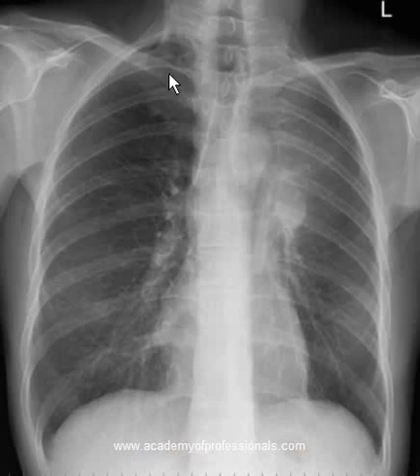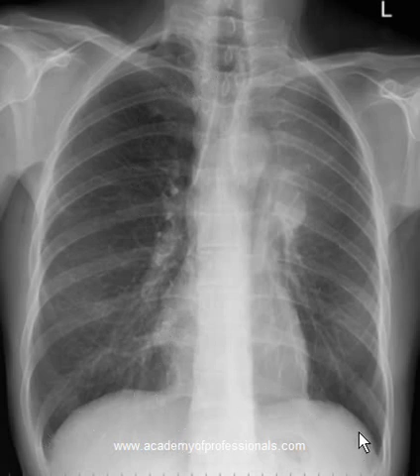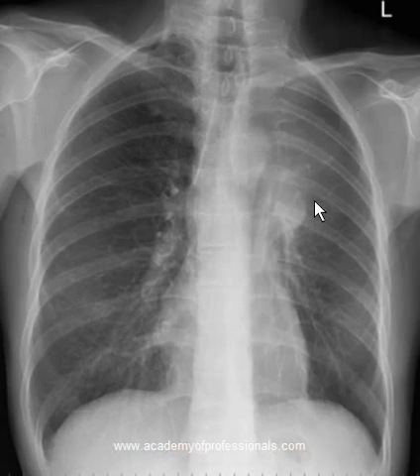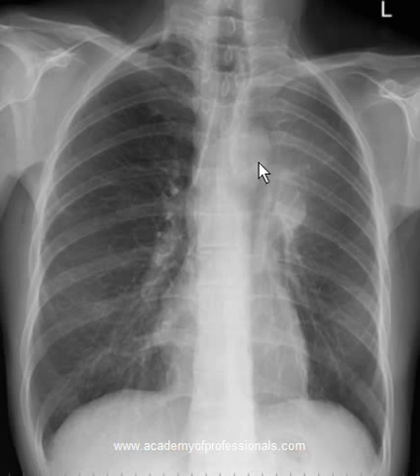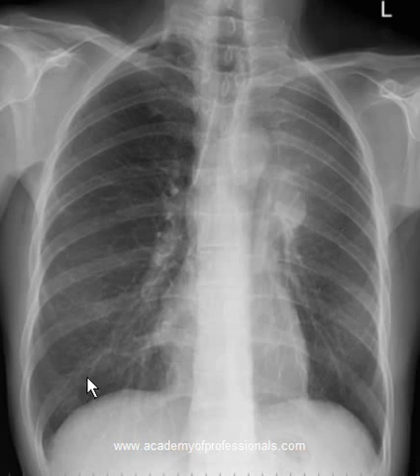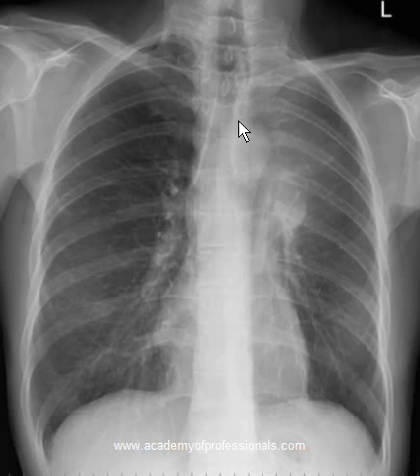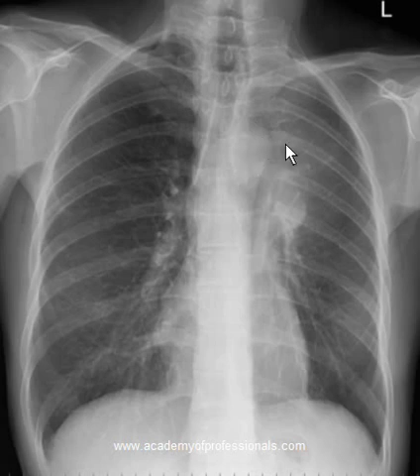This is a chest X-ray with very good inspiratory effort offered by the patient. Almost instantly you notice there's a difference in densities in the right and left upper zones. The right upper zone is well aerated with vesicular markings clearly visible, whereas on the left there's a diffuse density in the left upper zone. Is this consolidation? There's no air bronchogram in this area. Both lungs seem to have equal volume, but this is not true. The aortic knuckle is not clearly visible, although there is an air density around it — it is not as clearly visible as it is on a normal PA view.